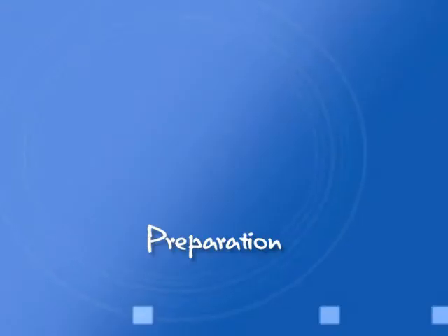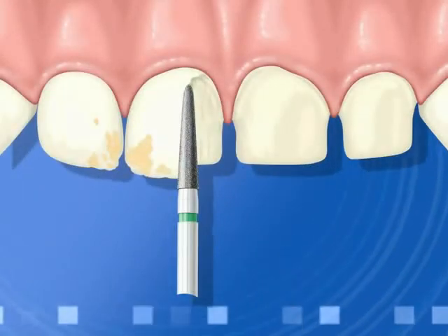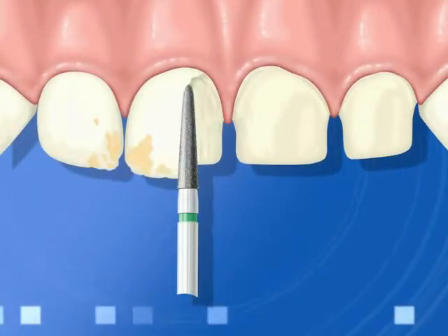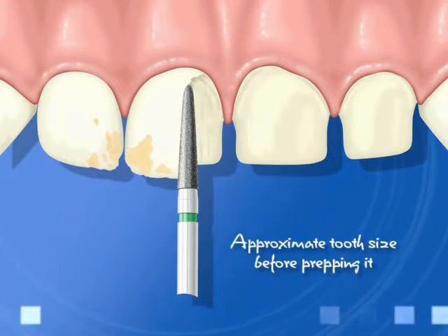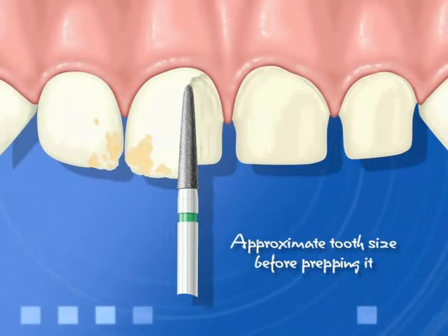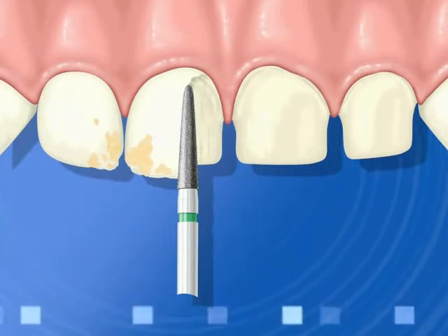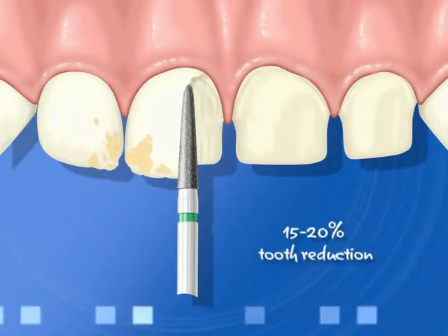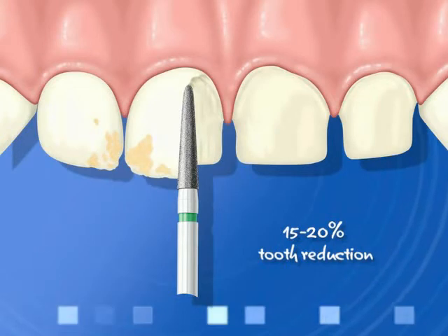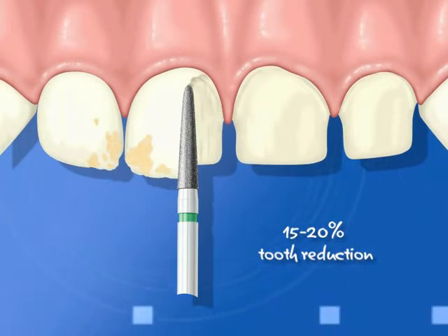Preparation. Preparation is very similar to the preparation for plain stainless steel crowns, with a little extra tooth reduction. It is best to approximate the size of the patient's tooth before prepping it. Typically, you may find that a crown one size smaller will work best for some cases. Our experience tells us you will need an extra 15 to 20% tooth reduction. Some dentists use slightly larger burrs than with a plain stainless steel crown.